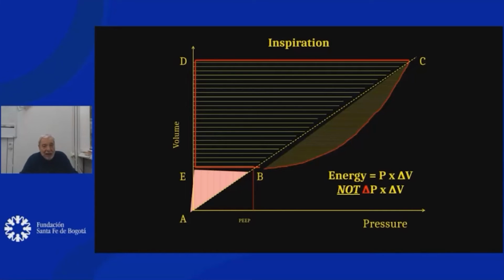What about PEEP? We have a lot of discussion about considering the PEEP part of the mechanical power. If you ask whatever engineer, he tells you yes. Because, to move the lung from this level of volume, I have to provide energy to reach this point, if not the lung deflates. After that, this is all the energy, pressure times tidal volume.